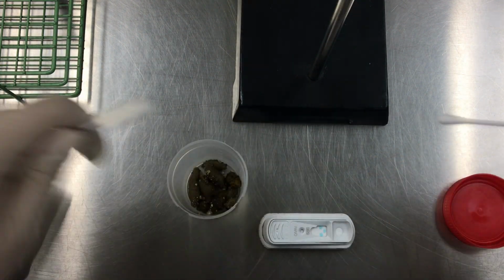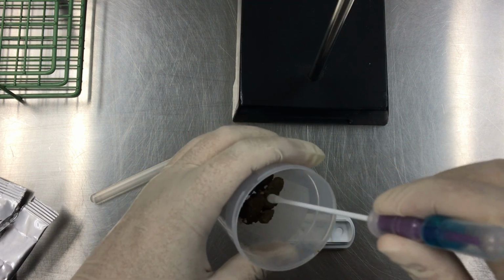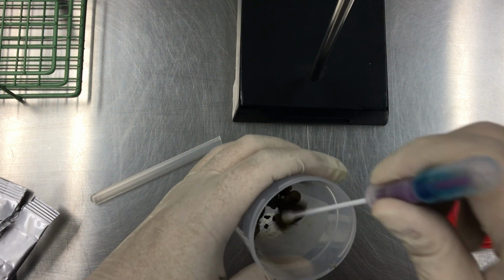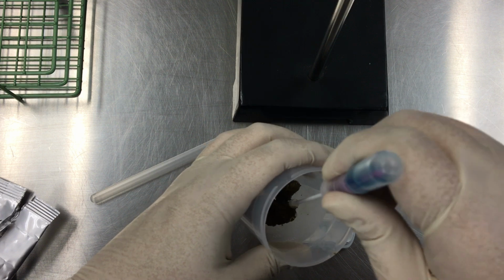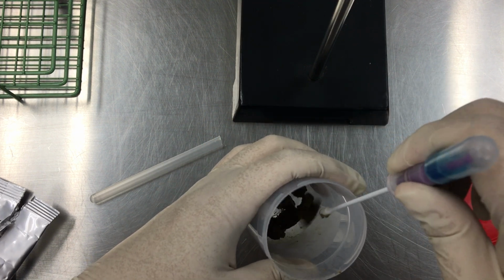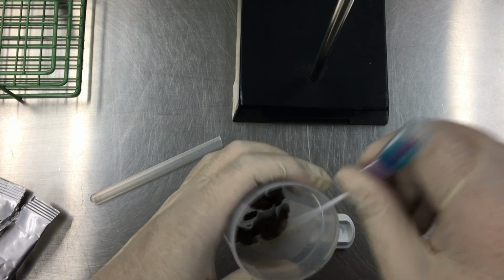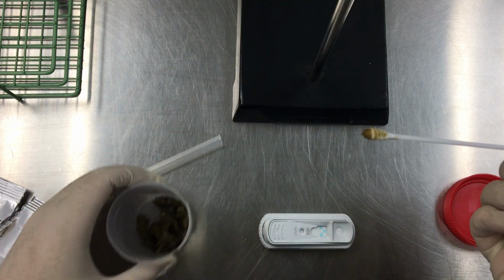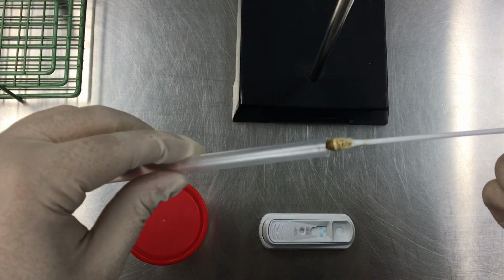Remove the sheath. And then you want to coat the end of the applicator with your fecal sample. If you don't have a fecal sample, you can insert this into the rectum to get a swab, but obviously this is the less invasive method. So it just needs to be a little bit coated. We're going to replace this back into the sheath.